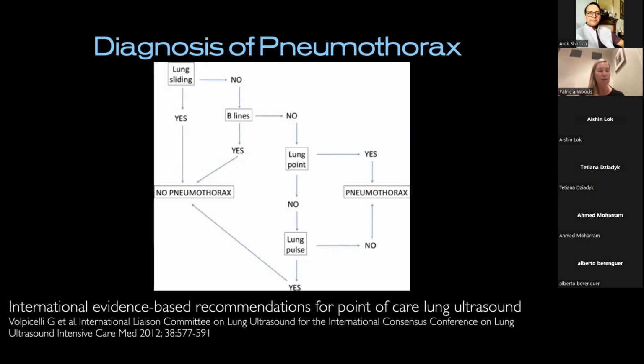And it might be moving the probe to other areas, or it might be changing from 2D to M mode to help you answer that. But it's just nice to know you're not going to get your answer with just one simple question.